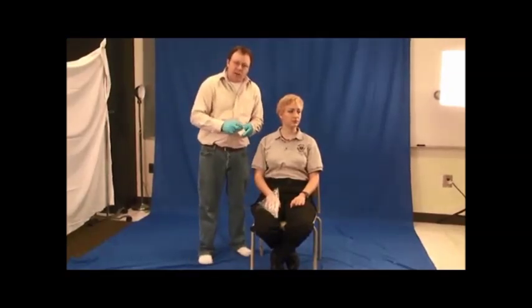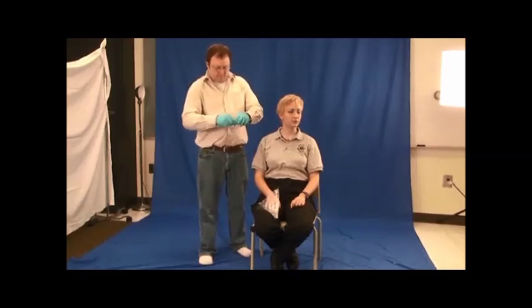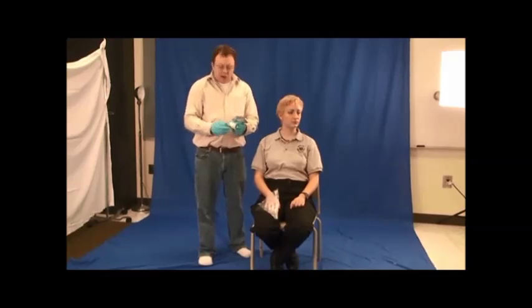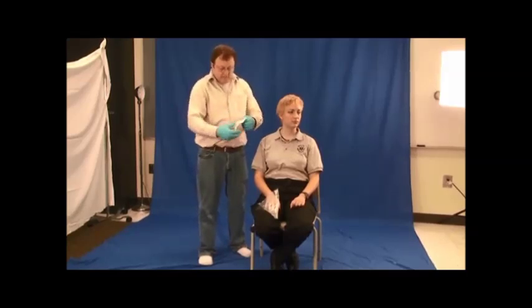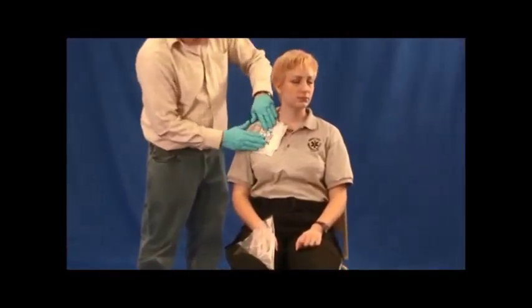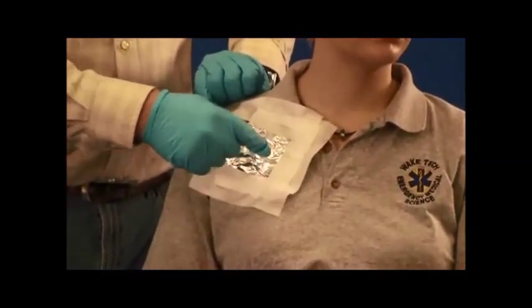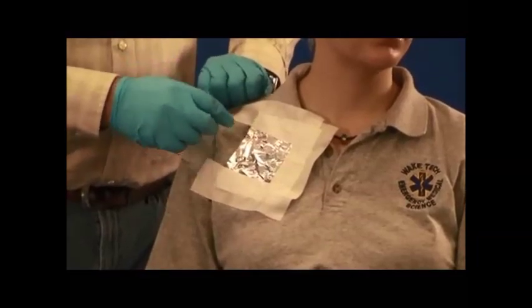When applying an occlusive dressing to a sucking chest wound, we create a flutter valve by taping down three of the four sides. This allows air to escape but prevents air from getting in. Air can escape from the flutter valve, but when the person breathes in, it will close off, decreasing the amount of air entering the pleural space and thereby hopefully decreasing the pneumothorax.